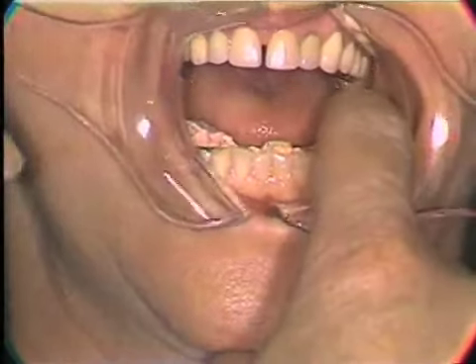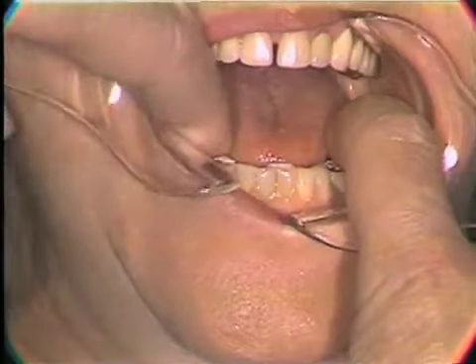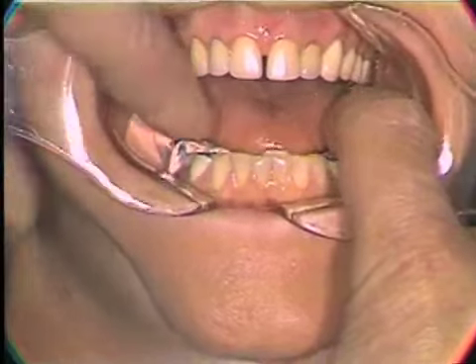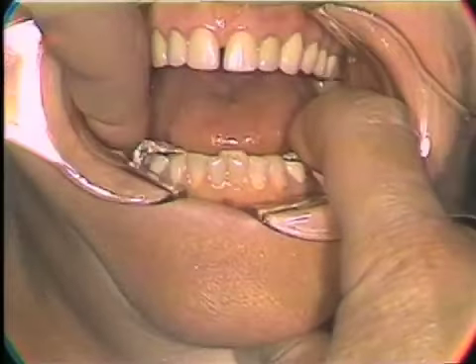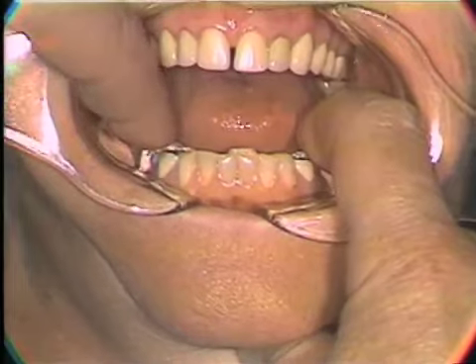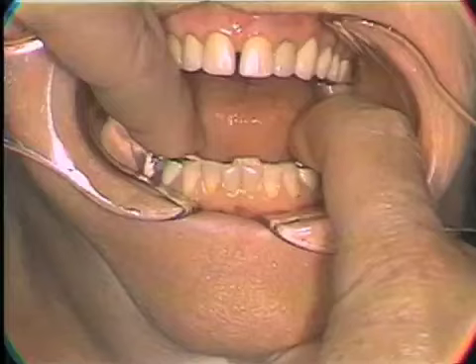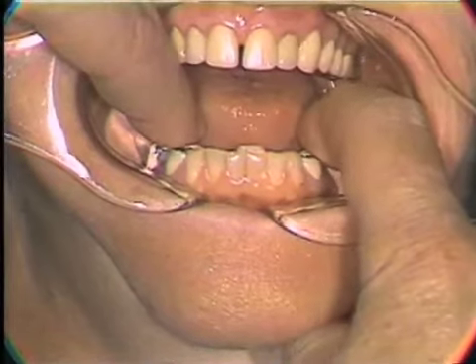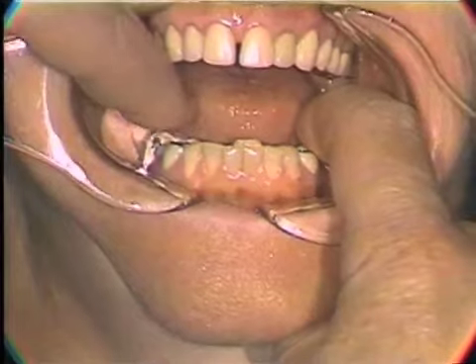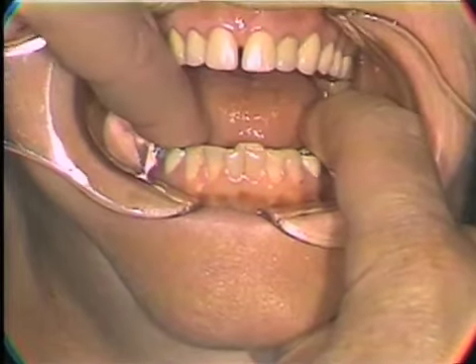The stability we want to verify is that once we get the impression seated against the ridge, we can apply a vertical force on this side and this side will not come up. Observe this side. When we seat the impression against the tissue, we apply a vertical force, and you can see that we're applying quite a force. This side stays in place. That is stability, and this is what we want.